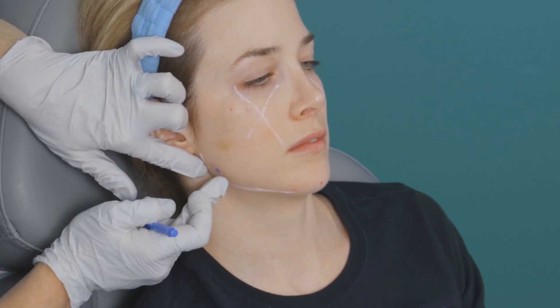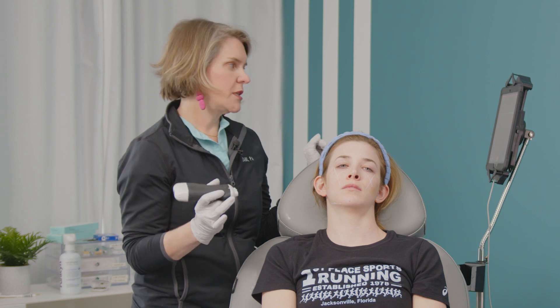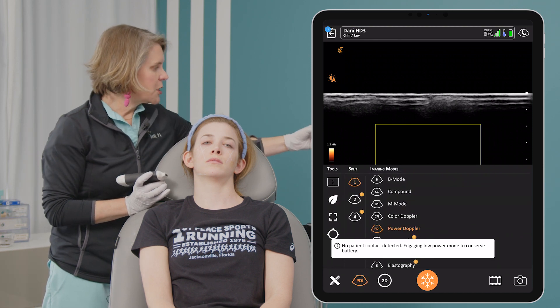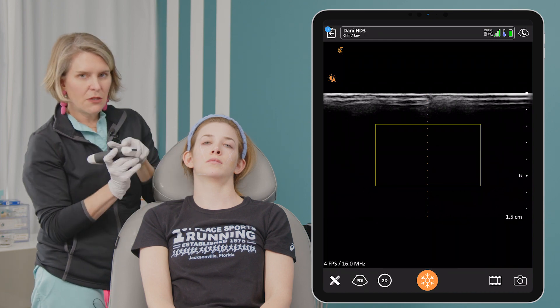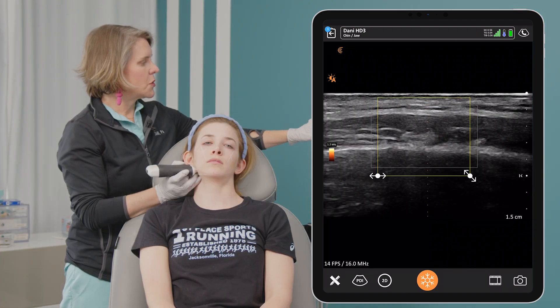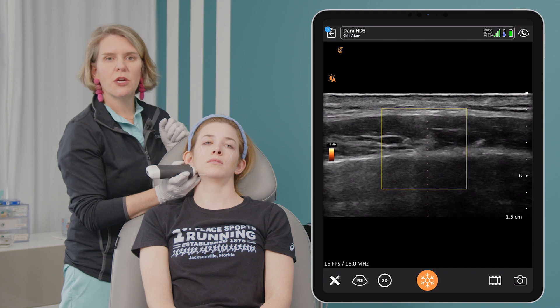We want to bring a little more definition to this area, so that's where I put this little dot. The dot is very important because that's where you're going to line up your midline marker — placing it exactly on that spot — and then do four different checks to make sure you've seen everything you need to see. The first thing we need to do is put on our power Doppler, and then put down our midline marker. The midline marker corresponds with the little hatch in the middle of the probe, and we make sure our color box is right where we want it to be, querying that area.